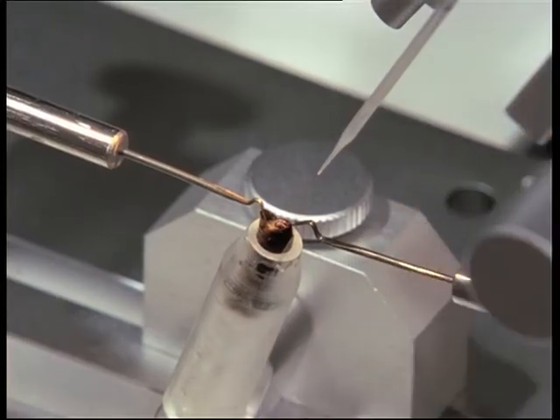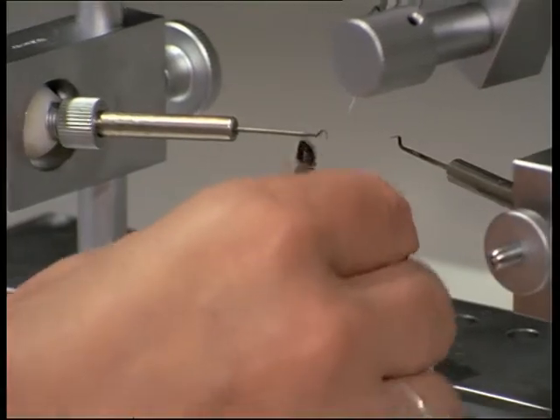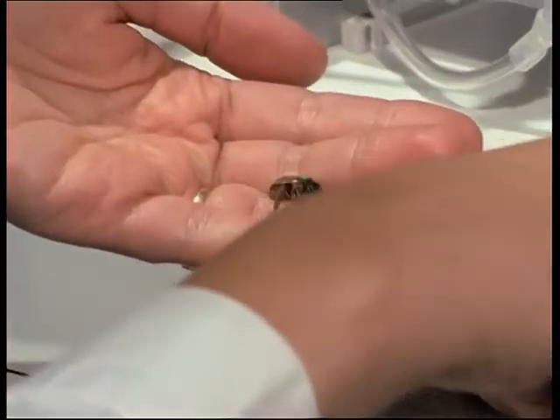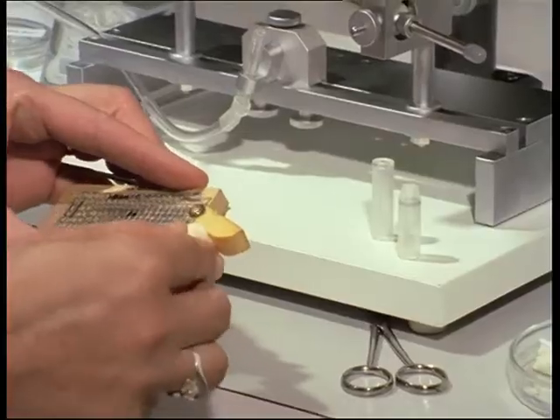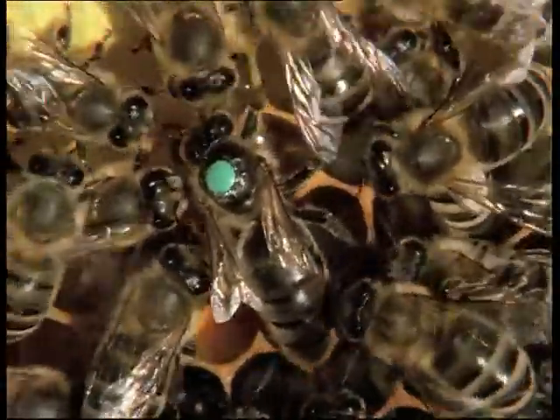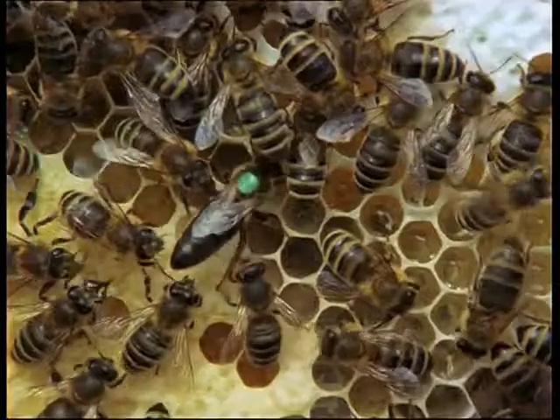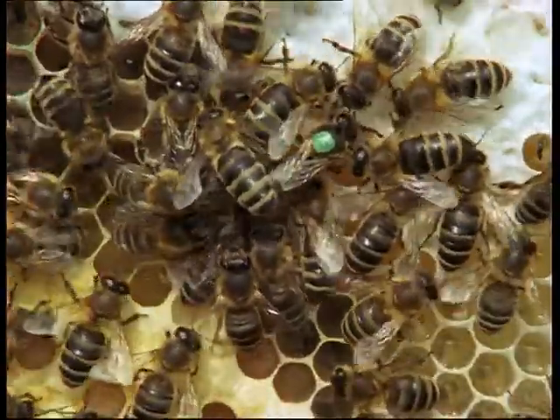This concludes the insemination procedure. The syringe and the hooks are removed. The still narcotised queen is released from the holder. Clipping one wing prevents her swarming later on, but it is nonetheless essential to cover the entrance of the mating cage with an excluder as well. Bee candy seals the cage and the queen is returned to her hive. The more favourable the brooding and temperature conditions are for the queen, the sooner she will begin to lay eggs. The egg is clearly recognisable as a small whitish rod close to the base of the cell. Capped worker brood confirms the success of insemination. The store of semen in her spermatheca will last for the queen's entire life.